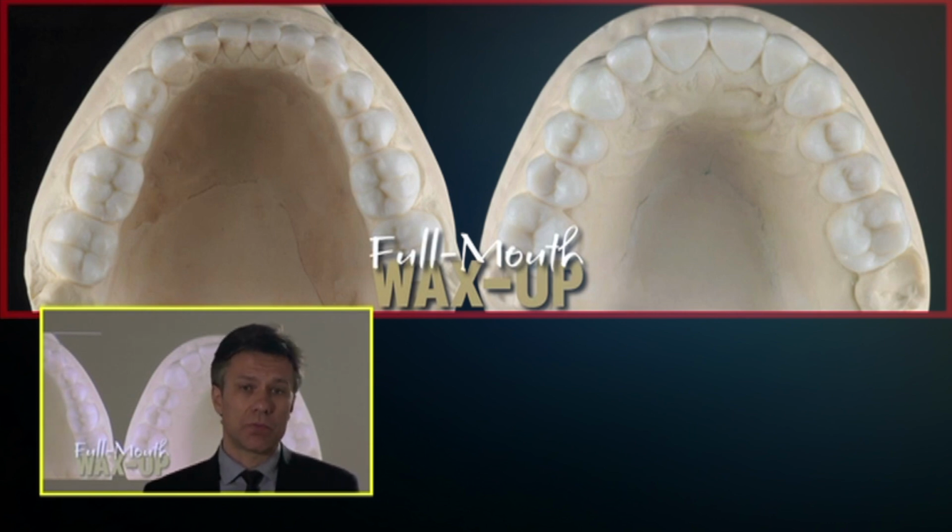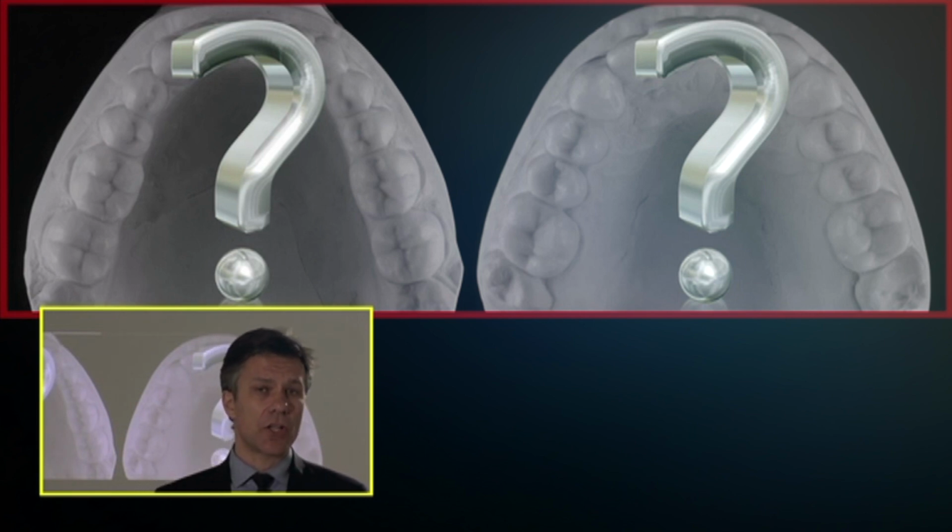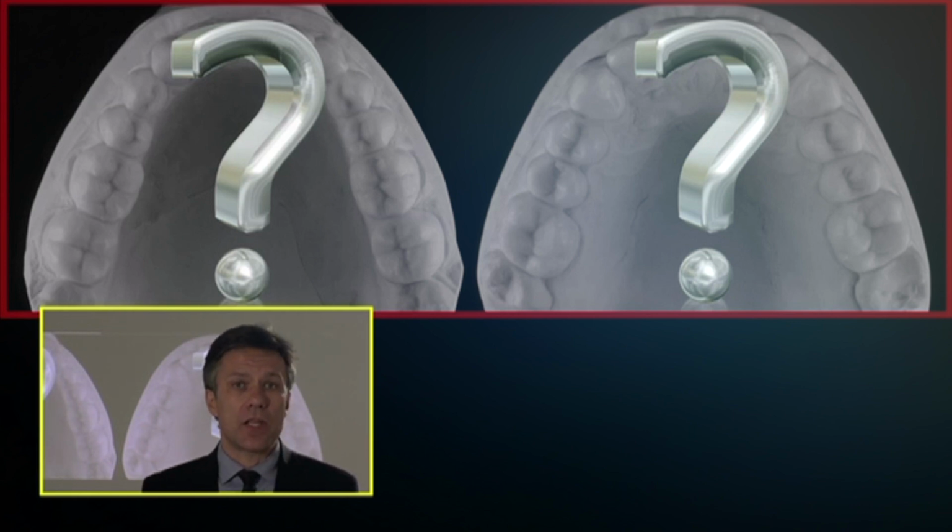You need a lot of time to develop that. So this is the full mouth wax up, but it doesn't give us too much reference because it was not tested. It looks nice on the articulator, but it's not tested. If it's not tested and if it's not approved, it's not useful so far. So what do we do?